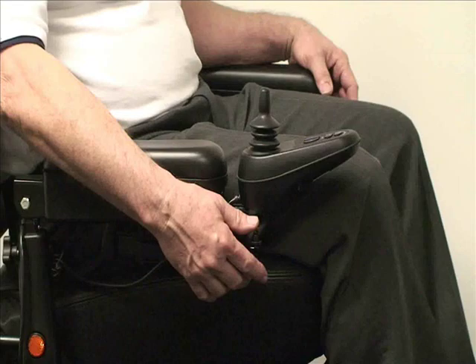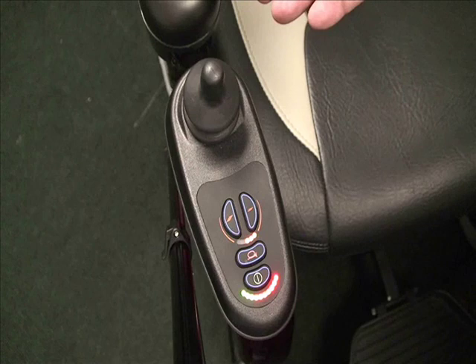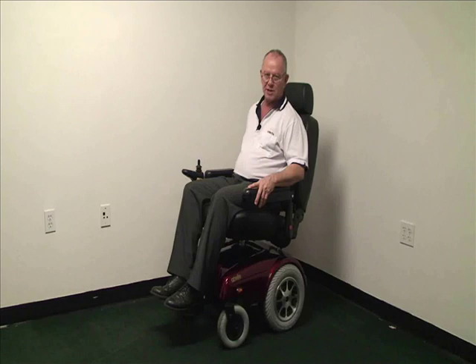A swing-way mount comes standard with the unit along with a Dynamic Shark joystick, allowing the user to enter or exit with ease. A programmable controller provides a wide range of selections to suit the needs and demands of different users. Height and width adjustable arms and a 22-inch wide swivel and recline capable seat, along with adjustable back and headrests, allow the user to adjust it to any comfort need.